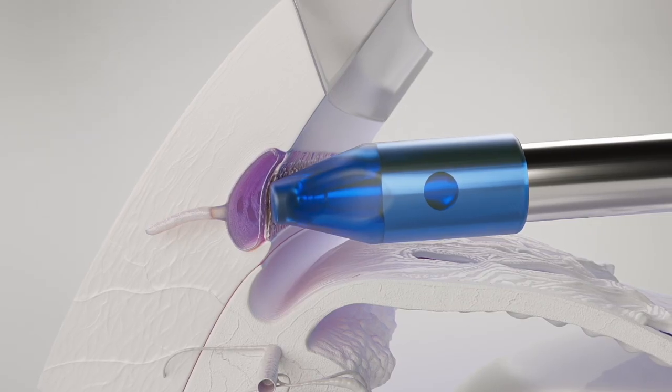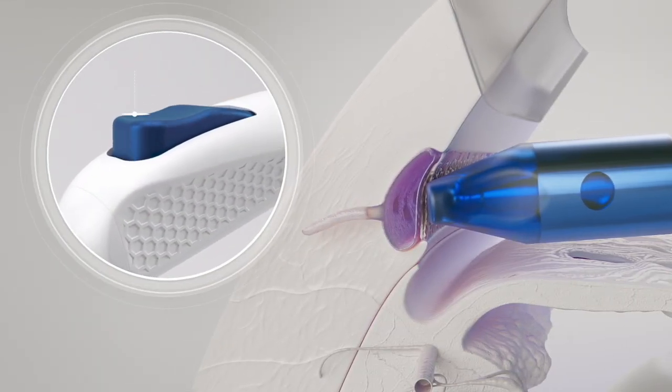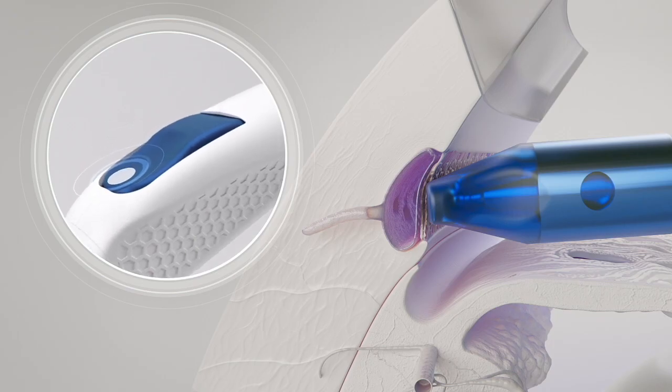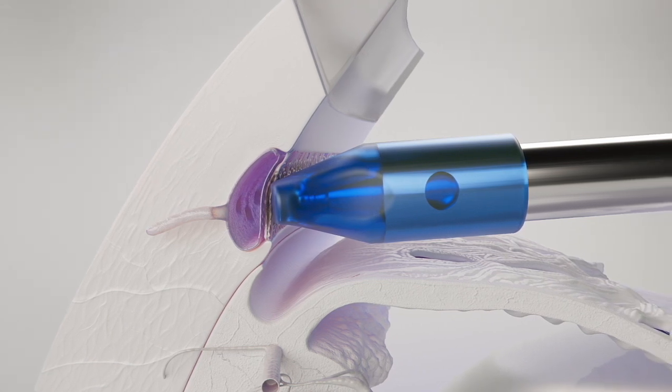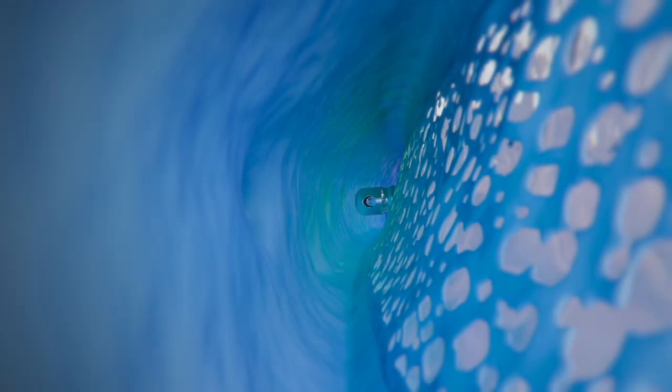Activate STREAMLINE by fully depressing the button in one smooth, continuous motion to create the initial incision in the trabecular meshwork and dispense OVD. Pressing the actuator button initiates the quick pulse technology, which in one seamless step causes the outer sleeve to smoothly retract, creates a precise incision as the trabecular meshwork encounters the inner cutting cannula, and viscoelastic is delivered into the canal of Schlemm.